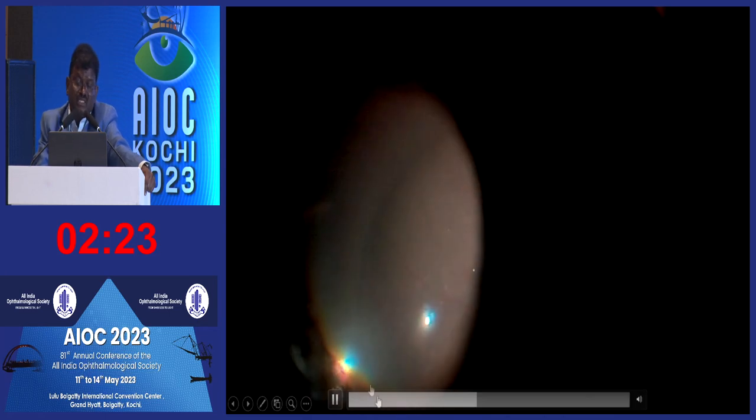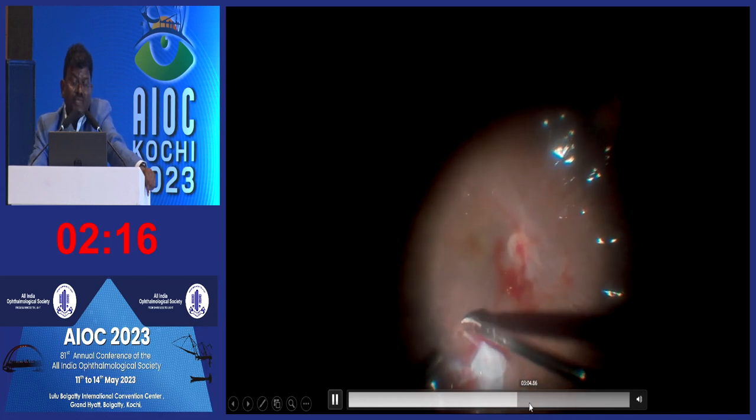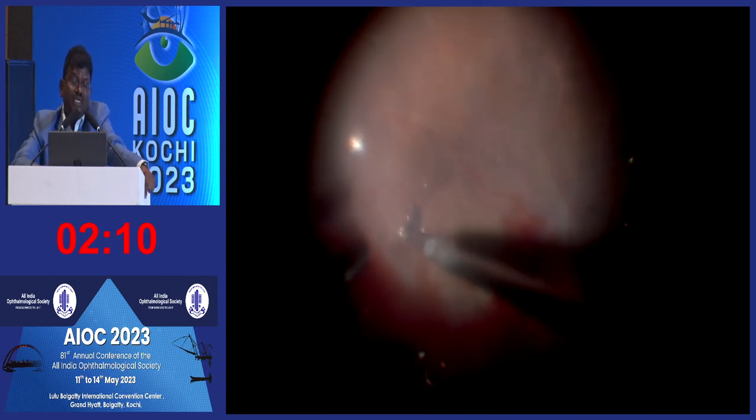Once the retina settles, just remove the pre-retinal gliotic membrane. It was quite tough, so we have to go again for scissors and the forceps. And peel after staining with the BBG under the PFCL, you peel the membrane.